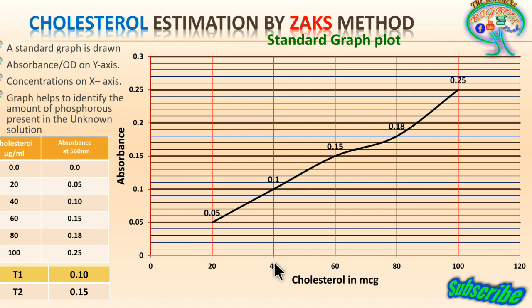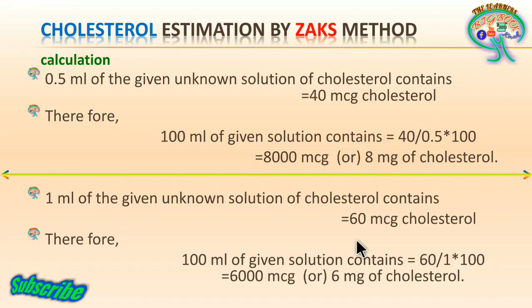Now next we are going to calculate the result. Under this we are going to consider the volumes.